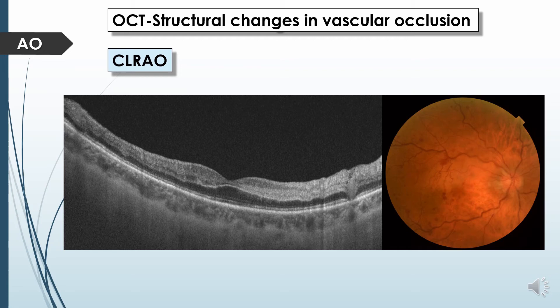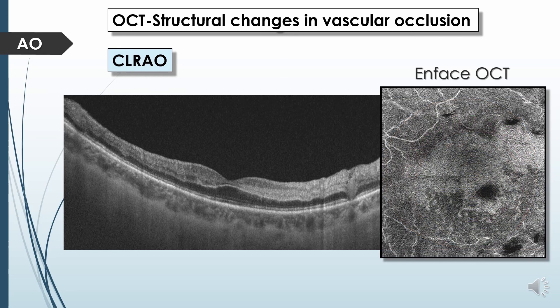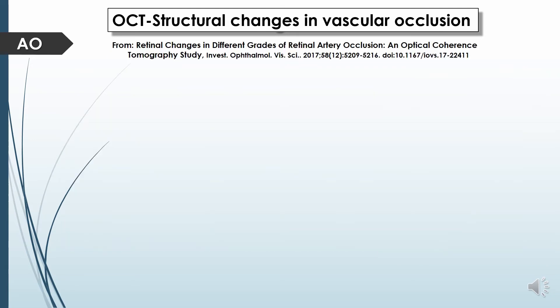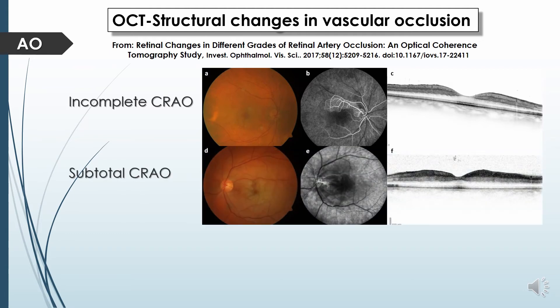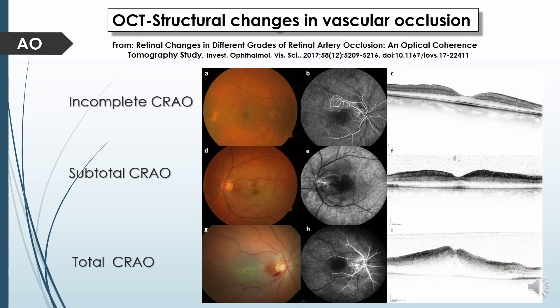B-scan and en-face OCT show hyperreflectivity of the inner retinal layer in the affected macular region. Grading for OCT features in central retinal artery occlusion classifies it into: incomplete CRAO — hyperreflectivity of the inner retinal layer without retinal thickening where different layers can be easily differentiated; subtotal CRAO — mild thickening with hyperreflectivity where layers can be differentiated with difficulty; and total CRAO — significant retinal thickening and hyperreflectivity where layers cannot be differentiated from each other.